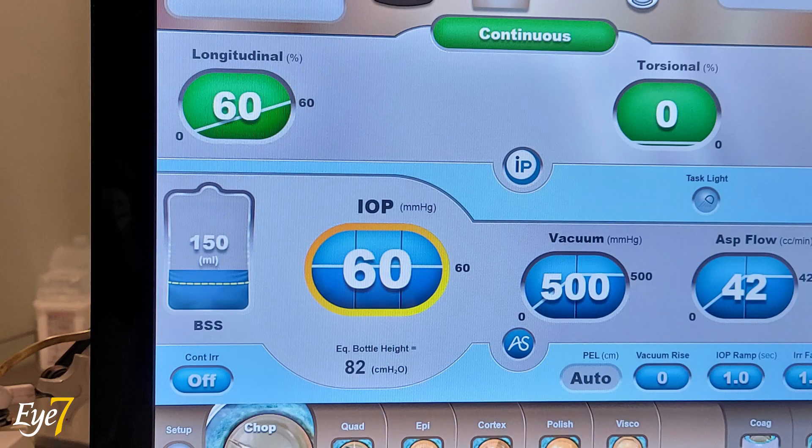These are the parameters. I am on longitudinal phaco — no torsional phaco. IOP at 60, vacuum at 500, and aspiration flow rate at 42.